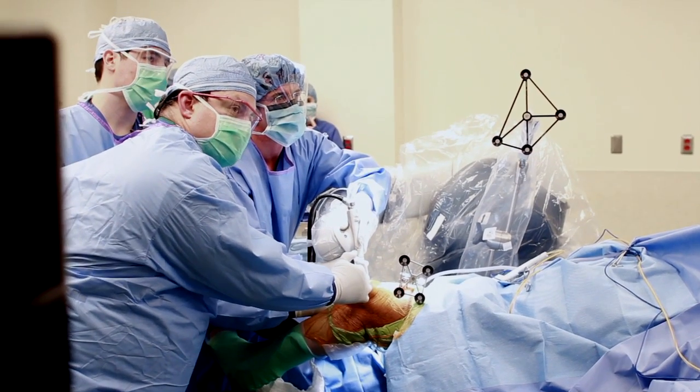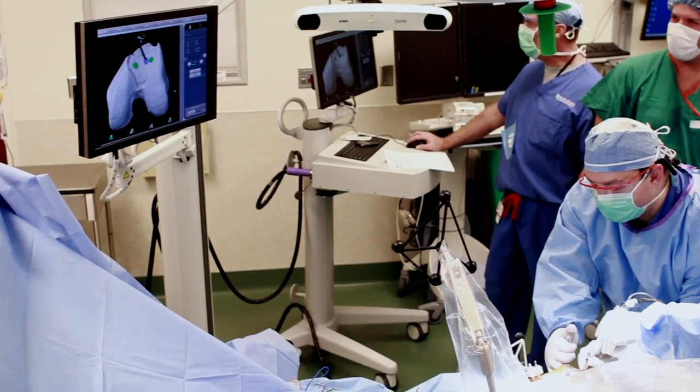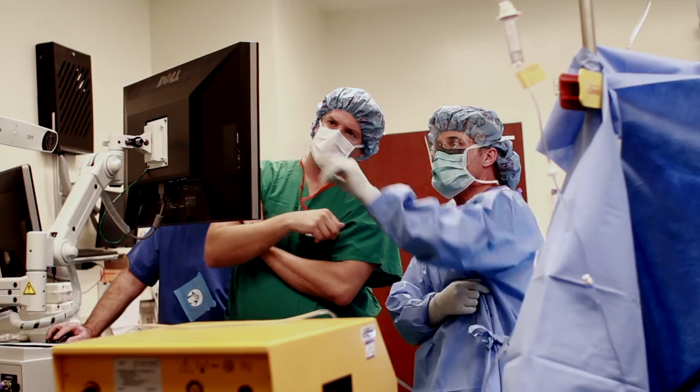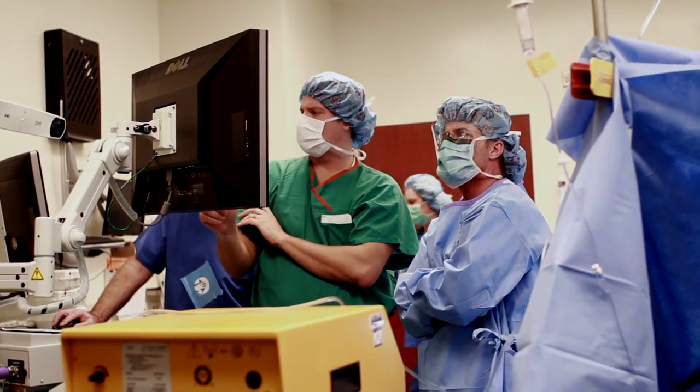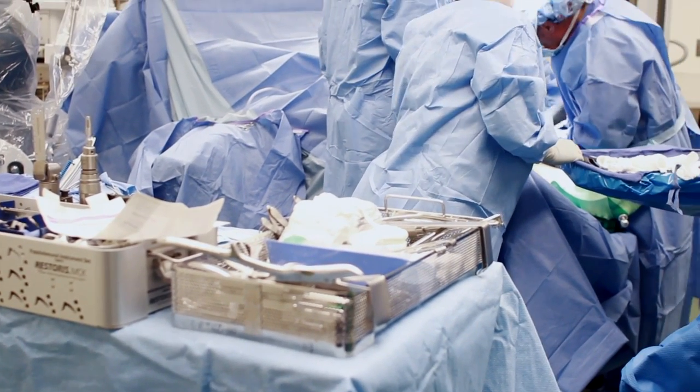Knee resurfacing — the concept is to just take off what you're going to put back. Instead of cutting larger amounts of bone, you just want to take off the minimal amount of bone that you need. It goes to the whole concept of less invasive surgery that we try to perform here at Mary Immaculate, and that I really try to perform.